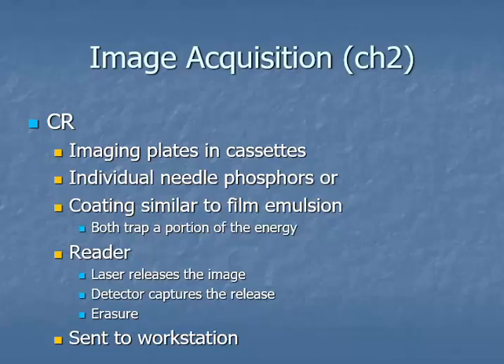Last semester's ASRT videos were pretty comprehensive, so we're not going to cover image acquisition, CR and DR in as much depth as we saw last semester. This will mainly be a review. Remember that we've got two different technologies, one of which you probably don't work with much, if at all, being computed radiography. Everything is going towards digital.